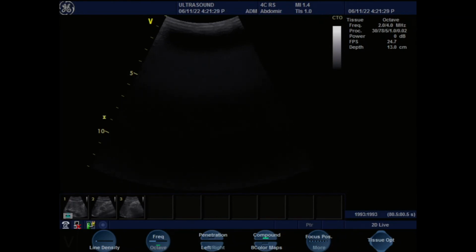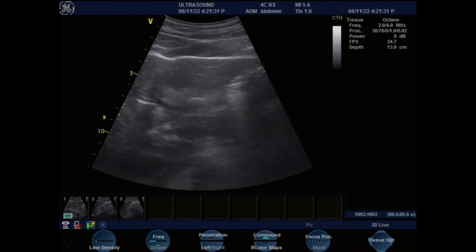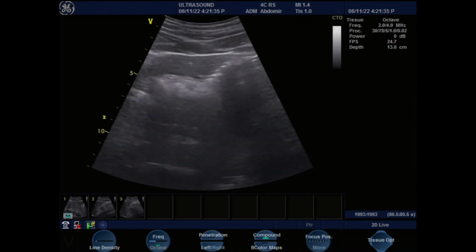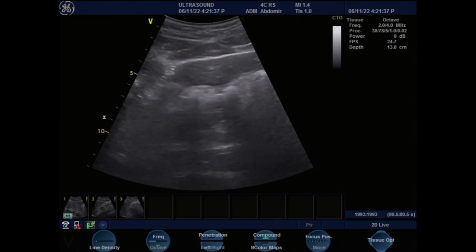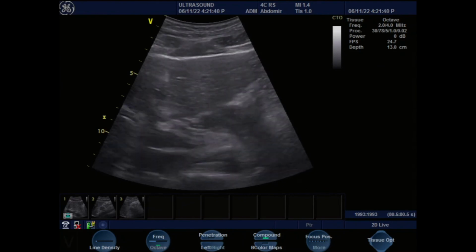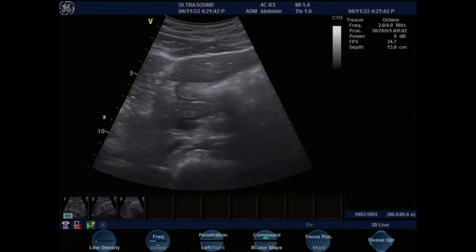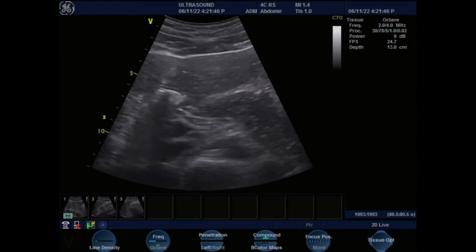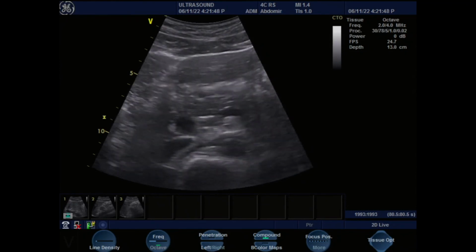So we are basically focusing on the pancreas and the gallbladder at this point. Very good. And we have the gastric area with the probe there. Turn slightly. So go here. Now we have to press a little because there is always gas there. The stomach is anterior to the pancreas, so we need to try and get that out of the way. There's a beautiful pancreas there.